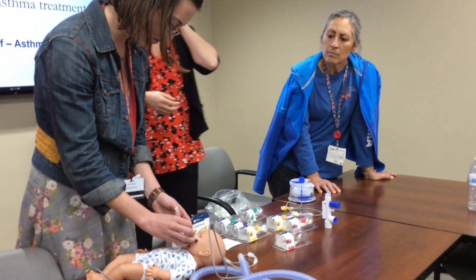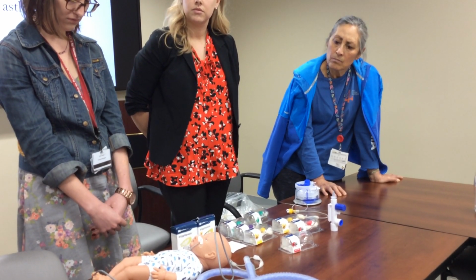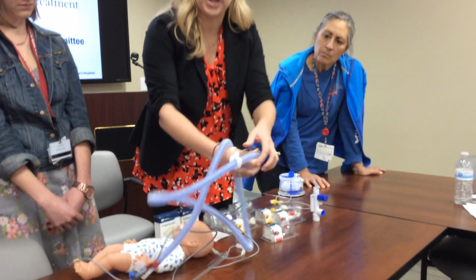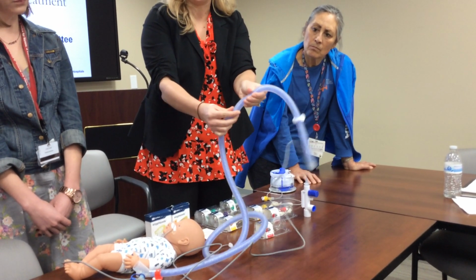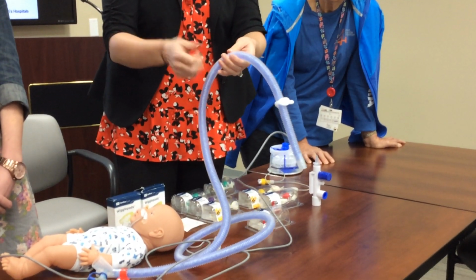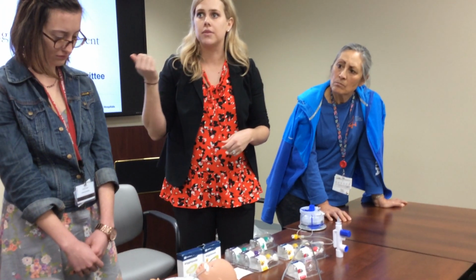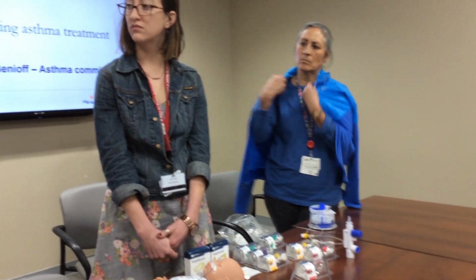Before, with the old plastic one, sometimes we'd pop it open where the large tube meets the smaller tube and dump all the water out. Do we have to do that anymore? The reason you would have to do that is because you get a lot of condensation or rain out in your circuit. If you notice, this is a clear circuit over a blue circuit on the inside. It acts like a sleeping bag, keeping it really insulated, so you should see a significant decrease in the need to drain it. If you do, you don't have to break it. You can just dump it back into the humidification chamber.